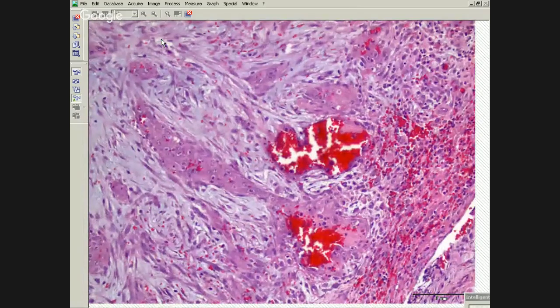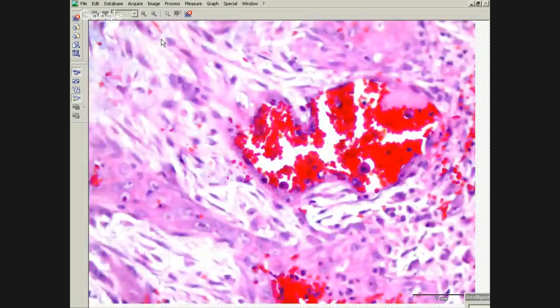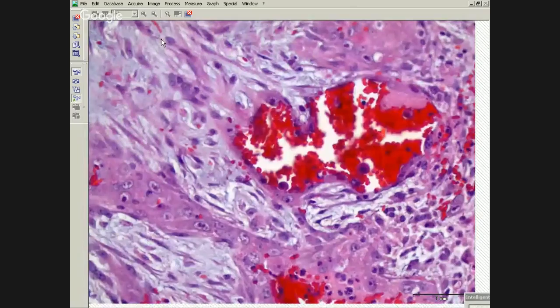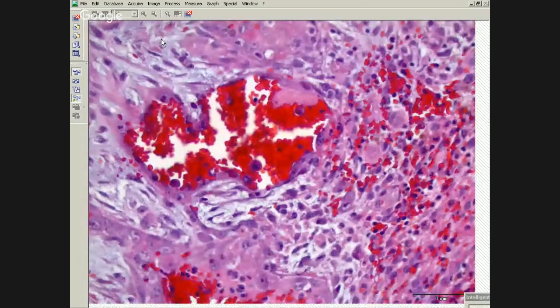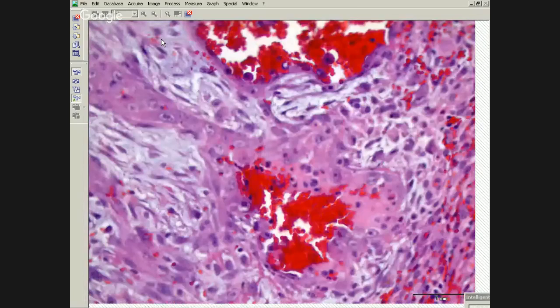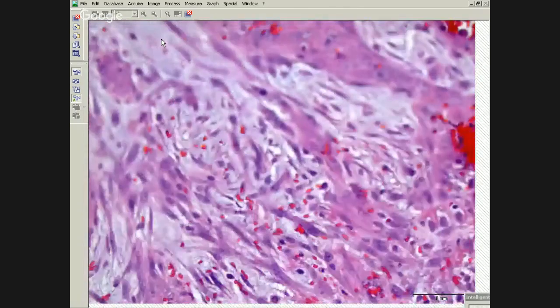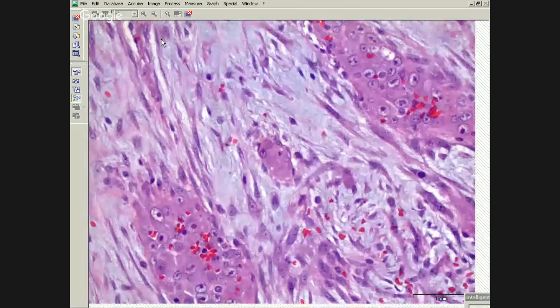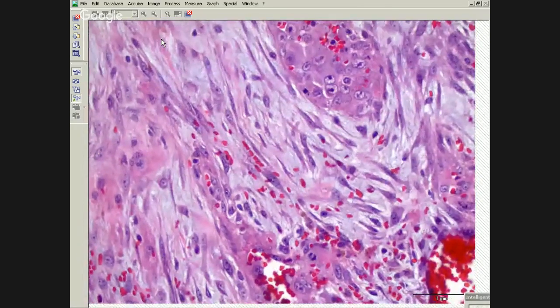At first glance, we're of course just thinking that's procedural from the biopsy. But if you look at the tumor more closely, you can see that at least some of the tumor cells are trying to make vascular structures. And I still can't seem to get the pointer working, but here we have one that's at least trying to make a vascular structure. If you look around, you can find some more of those that you probably thought was hemorrhage to start with.